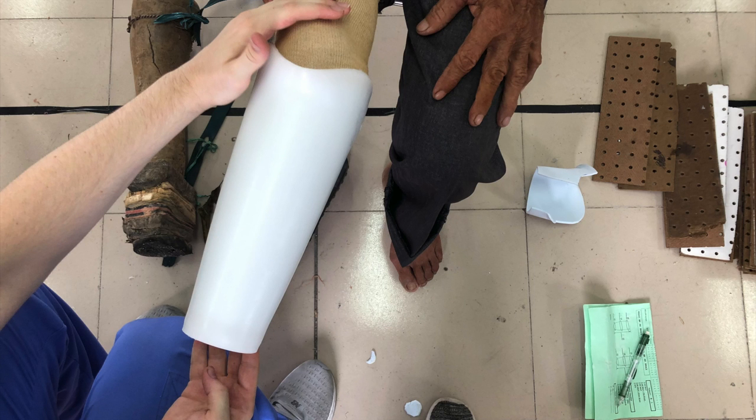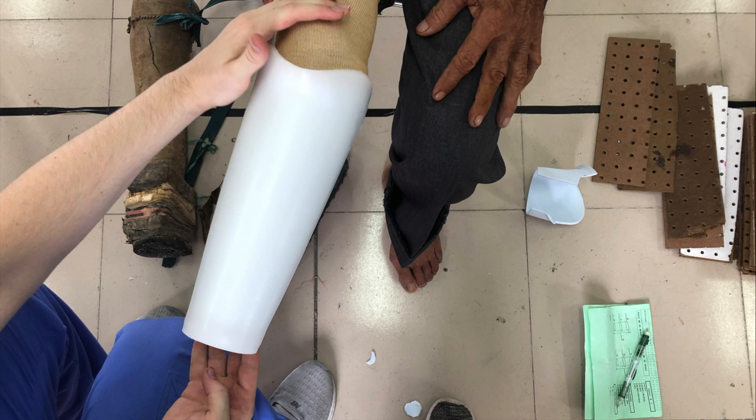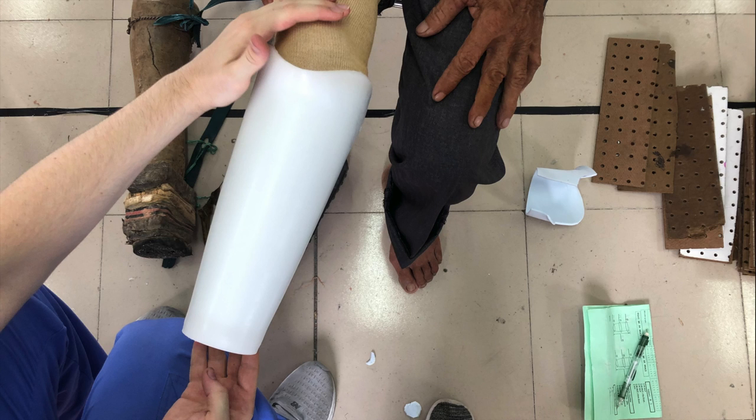Have the patient extend the leg and check to see if they are valgus or varus. Our patient was very valgus. The valgus can be caused by bony protrusions, too much space in certain areas, or the wings not being properly flared. A good start to correcting the valgus is to bend out the medial side of the wing. Often you'll need to bend in the lateral side, but this can be done at a later time.